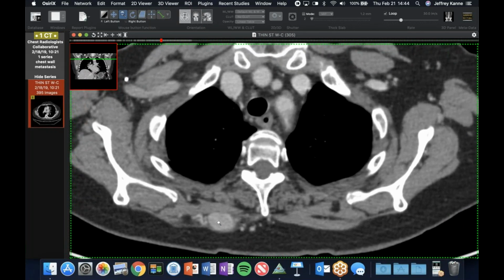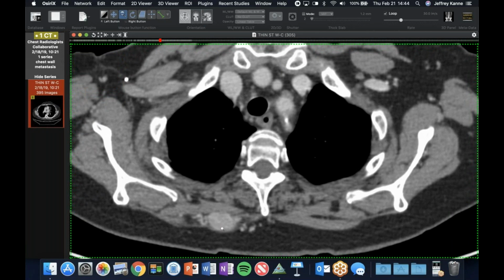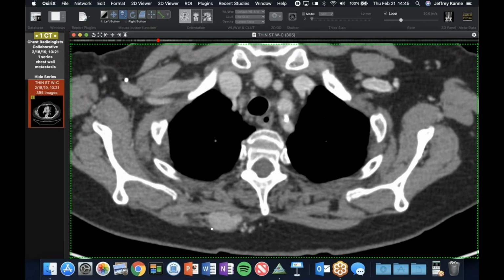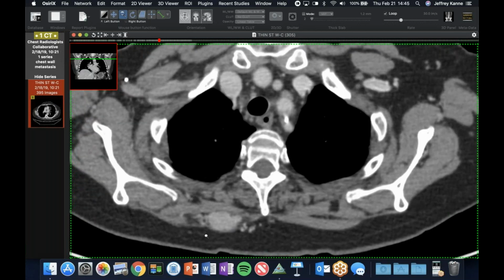She's clearly had an indolent tumor, but with renal cells, the longest I've seen is like 20 years after nephrectomy with metastasis showing up. Other ones you might think about doing are melanoma, but they tend to be a little bit more aggressive across the board. The other differential would be other vascular tumors, but in this setting, this is a nice example of this. And easy to miss. Interestingly, we found a second one the same day. One of my colleagues did, more subtle than this one, because this was high on our radar. But it was really neat to see the vasculature from the chest wall going into these.